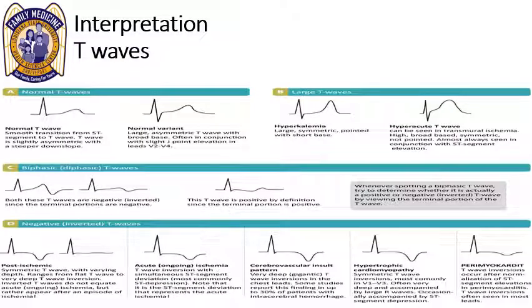So moving on to your T waves, the one that we really need to worry about is whether it's upright or inverted, okay? You see here we have a normal T wave, normal variance. Within the upright and inverted, do we have really upright T waves, which would be hyperkalemia? The way I learned about it is it's called the witch's hat. It would hurt to sit on it. These are usually going to be potassium greater than 5.5. And in our fluids lecture, we have further elaboration on potassium and how that affects the T wave morphology.